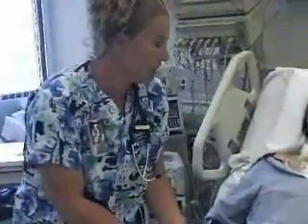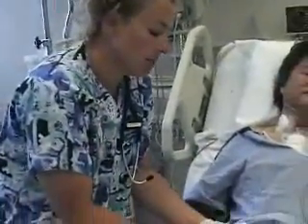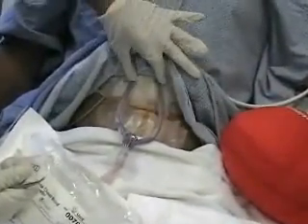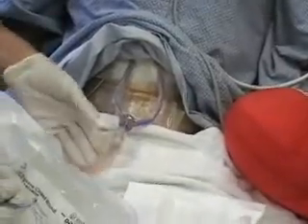Hi, my name is Jennifer, and this is Mike. He has chest tubes. He's supposed to have day one CABG. He has two chest tubes that come out, bifurcate into one, and this tube down here leads to the suction — the atrium suction.